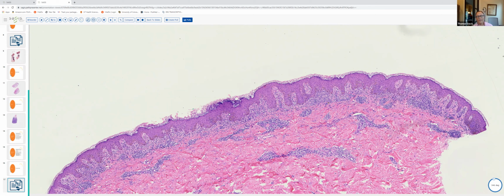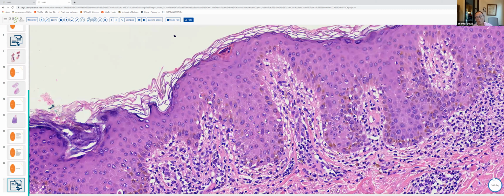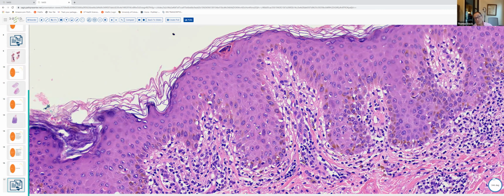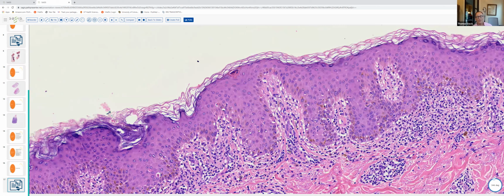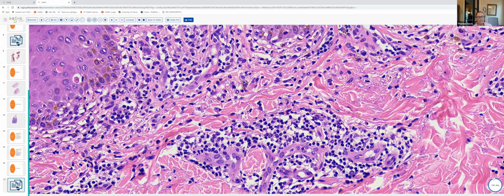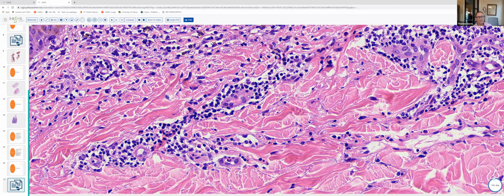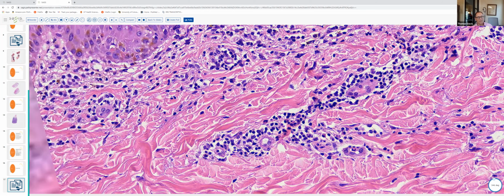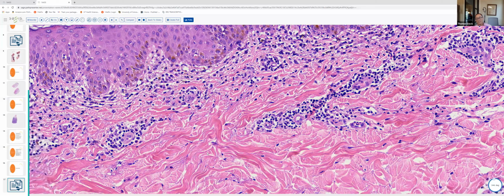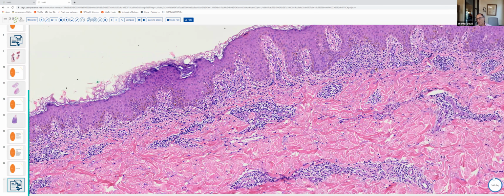If we look along the DEJ, once again, we have vacuolar alteration. There are scattered necrotic keratinocytes here within the epidermis, although we don't have the degree of epidermal necrosis, spongiosis, and ballooning in this particular example of a fixed drug eruption. And if we look at the inflammatory infiltrate, not only do we have lymphocytes and melanophages, but if you look in the dermis here, you begin to see large numbers of eosinophils within the infiltrate. And if you have an interface dermatitis with necrotic keratinocytes, and you're trying to distinguish EM from fixed drug eruption, if you begin to see eosinophils in numbers, it's a fixed drug eruption. It's not Erythema multiforme.